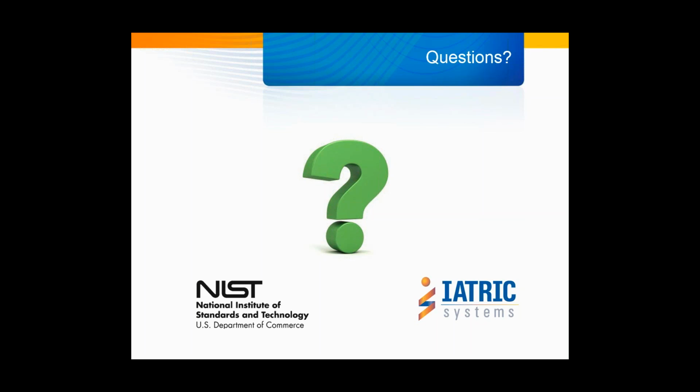Okay, thank you. The next question is, does IHE PCD enable bidirectional communication between a device and EHR? Yeah, so the answer there is yes. What happens, as Zach said earlier, is the device is normally coupled to a software gateway, and the gateway will map that information into HL7, and then that goes out into the EHR.